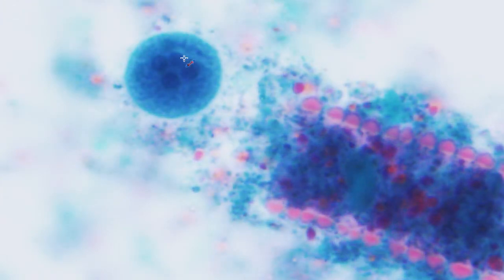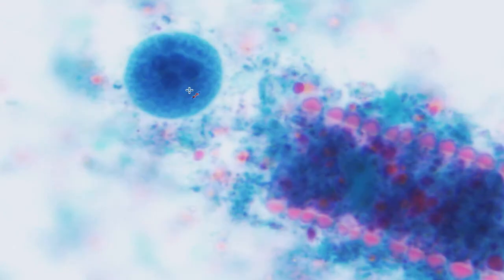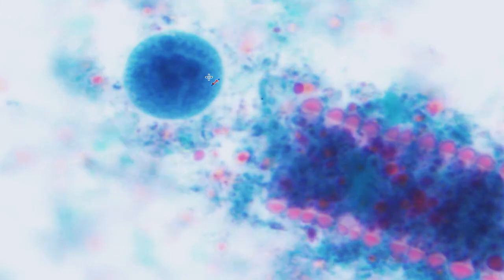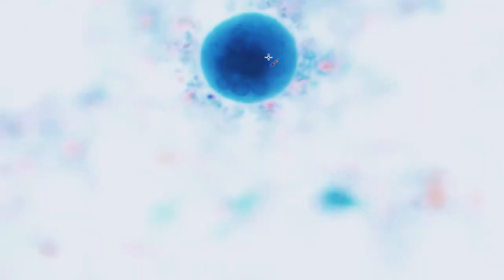Here is another cyst of Entamoeba coli, 4, 5, 6, 7, 8 nuclei. And you'll see uneven peripheral chromatin. You have to kind of imagine a little bit, but I think it's a bit heavier there. Quite eccentric karyosome on that particular nucleus. The nuclei are quite small compared to the size of the cyst as well in many cases.